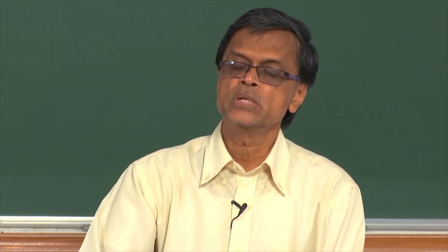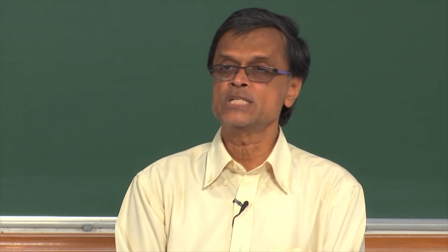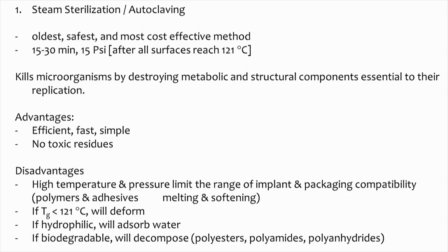Same thing we can do with temperature also. Suppose I want to think about whether I should use 80 degrees, 90 degrees or 100 degrees. I can do the sterilization at various temperatures, see what the killing rate is, and then decide on what should be my optimum temperature.